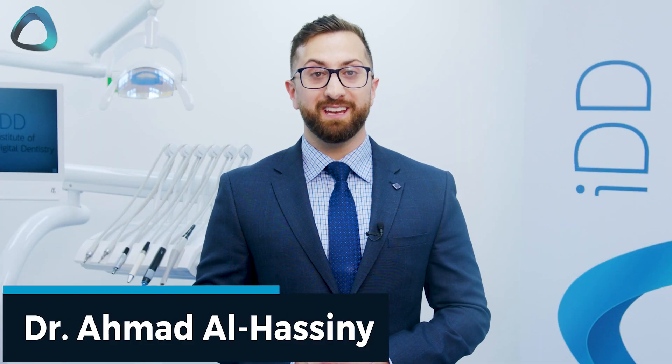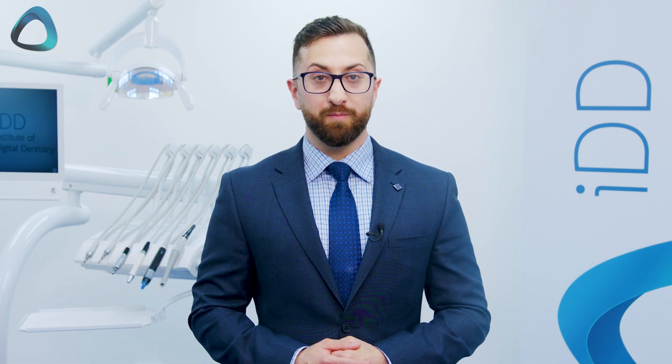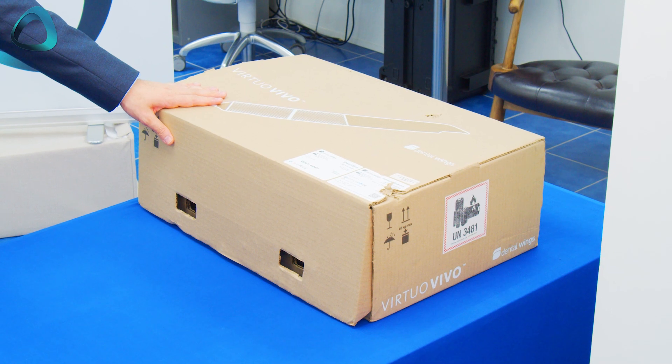Hey, it's Dr. Ahmed Al-Hasni here from the Institute of Digital Dentistry, and today I have another scanner unboxing video for you. This time it's the Virtuo Vivo by Straumann.